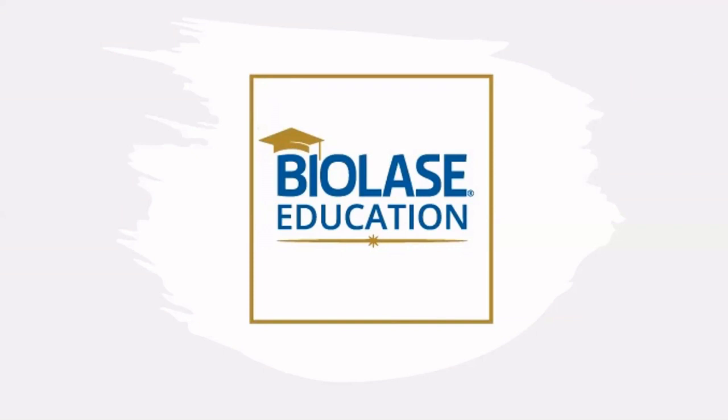Right. Yeah, we always suggest that when you do your first depigmentation, you do it in a posterior area that the patient cannot see, and that you tell them that you're trying it out, so you get the practice. Then when you feel comfortable with it, you move on, because in both of these subjects, patients can see. It's one thing doing crown lengthening in the posterior. Here we're doing something where patients can see. And you brought that out very well with the emphasis on the smile. Waleed, thank you very, very much for sharing with us.